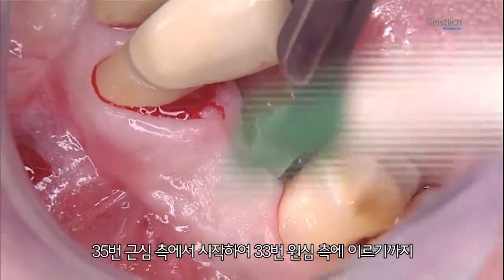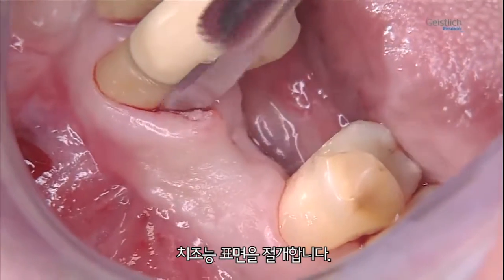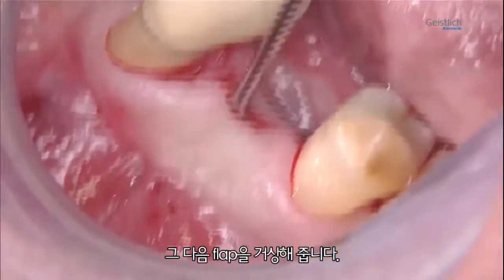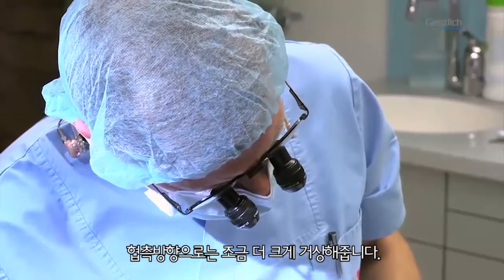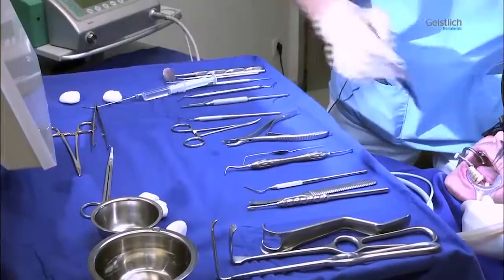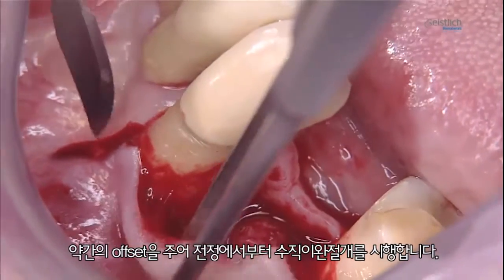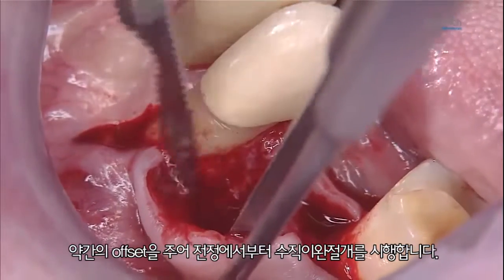The surgical procedure starts with a ridge cut from mesially of tooth 3-5 to distally of tooth 3-3. This is followed by an initial mobilization of a flap, more cautiously in the lingual direction and more determinedly in the buccal direction. A relief incision vestibularly of tooth 3-3, slightly offset toward the mesial surface of the root, allows further elevation of a mucoperiosteal flap.